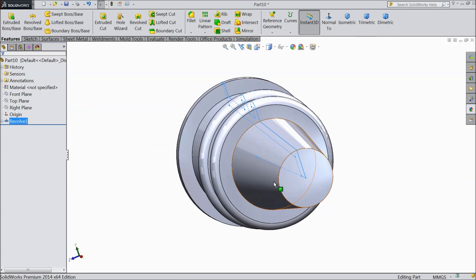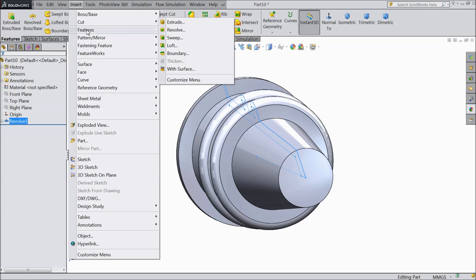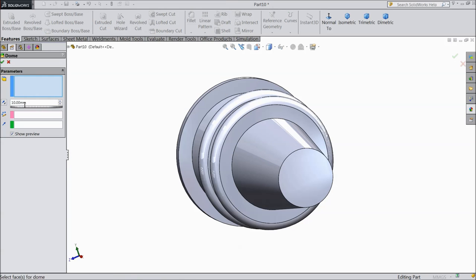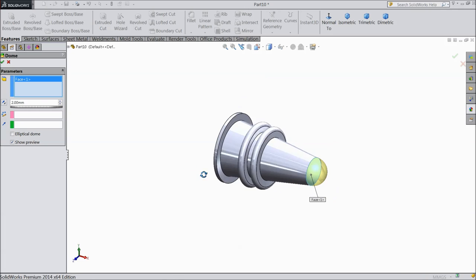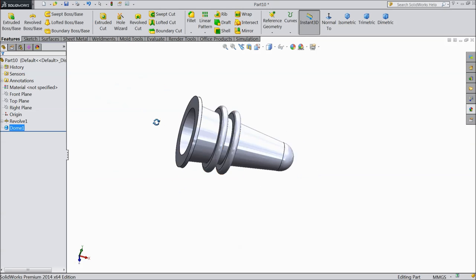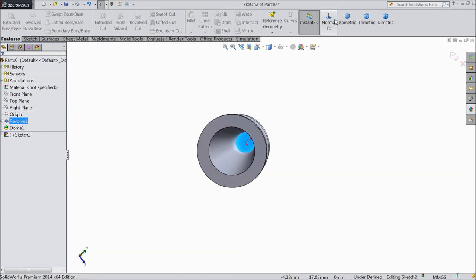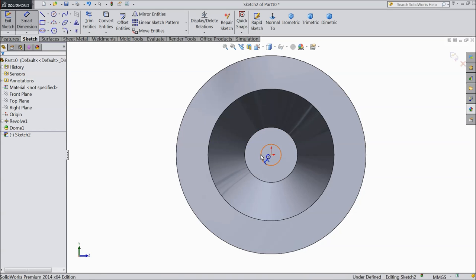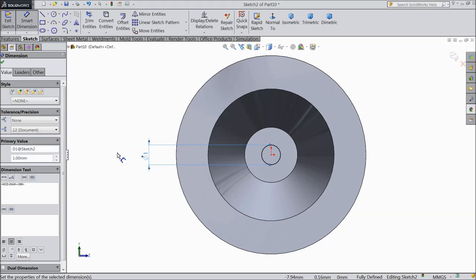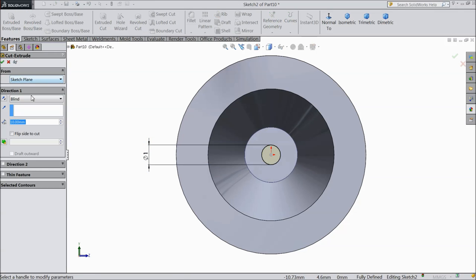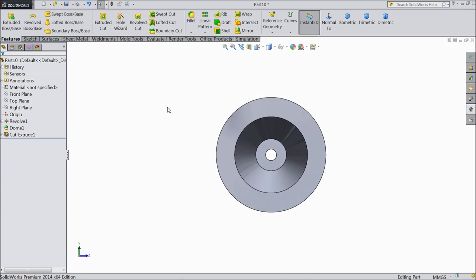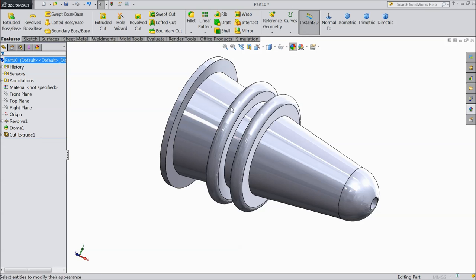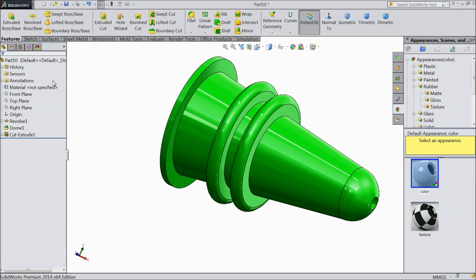Now we will make some dome here — go to insert, feature and select dome. Keep 2mm, select this face. Now select this face, sketch normal, and here we want to make a hole for the needle — make the diameter 1mm. Now select extruded cut and choose through all. Now this is the body or hypo body. Assign this color.